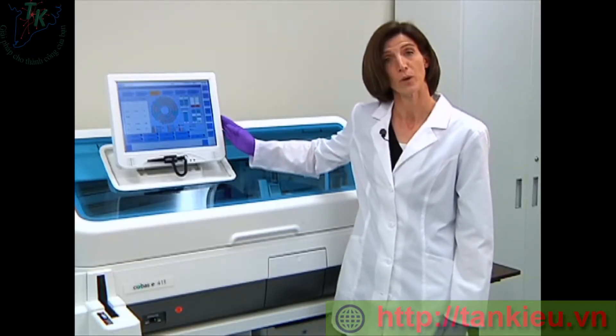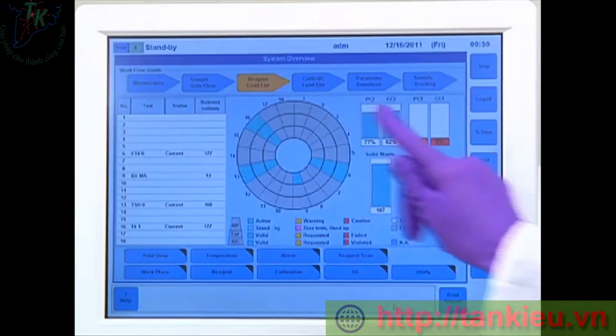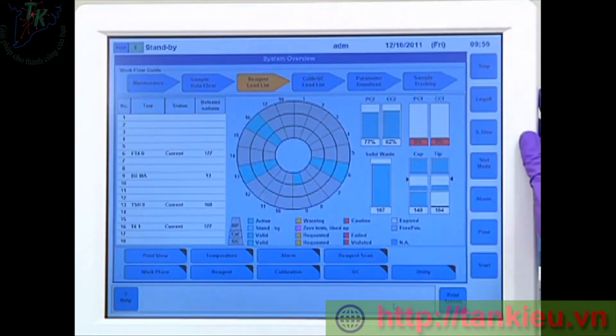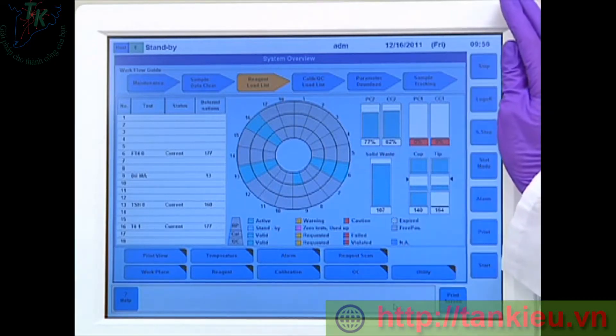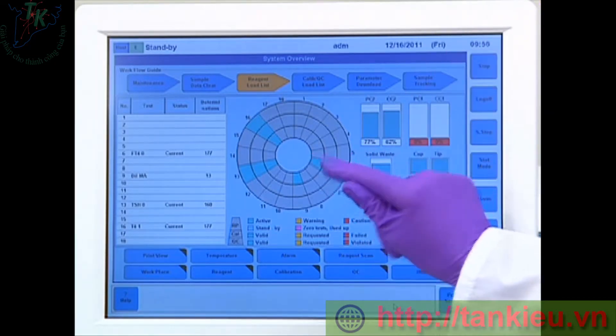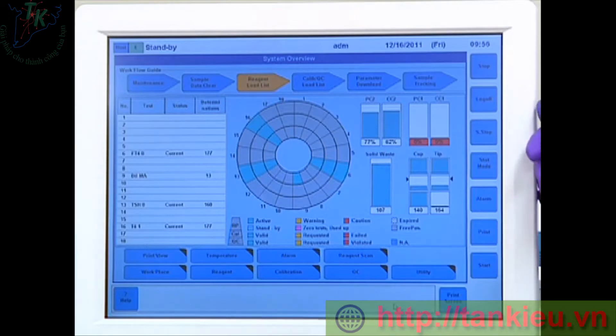The software uses color to direct our attention to the different areas that need to be attended to. First, what we're going to do is take a look at our reagent inventory. If we look in the center of the screen, we're going to see an image of the reagent compartment. If I had a reagent that was empty, I would be able to see red on the screen. If I had a reagent whose lot had expired, I would see cross-hatches throughout the wedge.